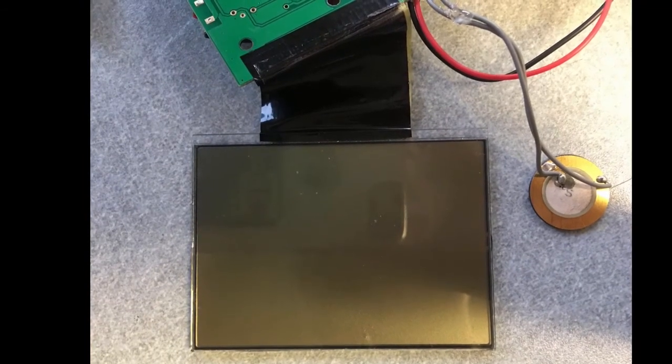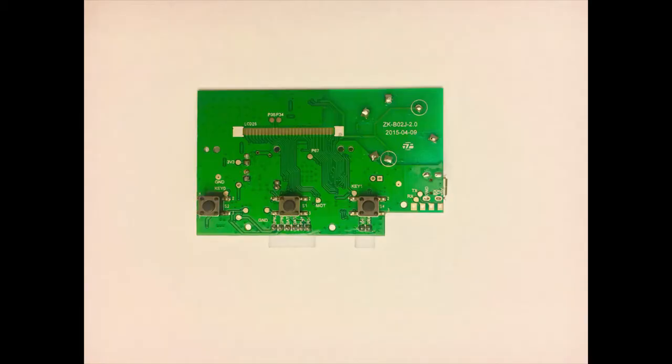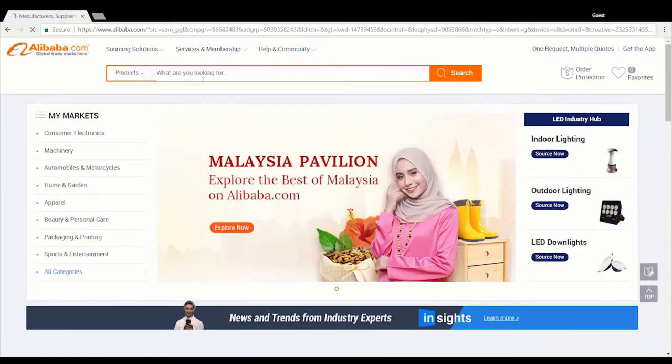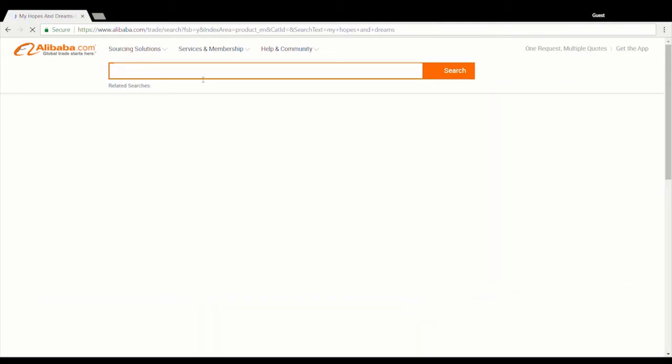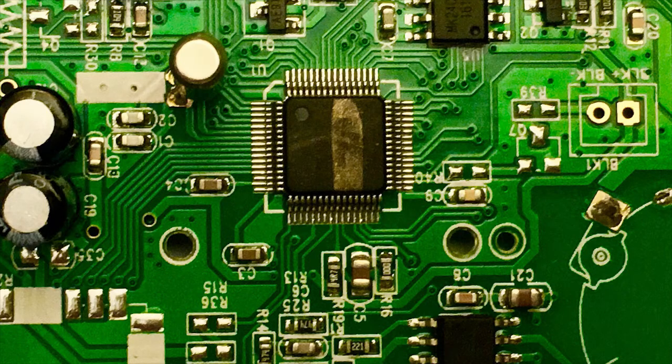The screen displays the systolic and diastolic blood pressures. There are many components on the PCB, including a microprocessor, capacitive pressure sensor, crystal, polarized capacitors, unpolarized capacitors, diodes, resistors, integrated circuits, a USB connector, pin connectors, and on the back, tactile switches that act as buttons. You can buy these components online from sources like DigiKey and Alibaba, but you cannot buy the assembled PCB — you'll have to assemble it yourself.